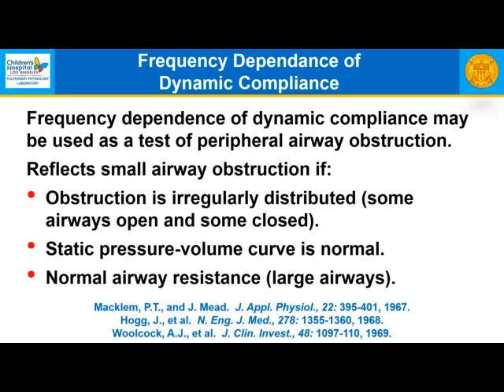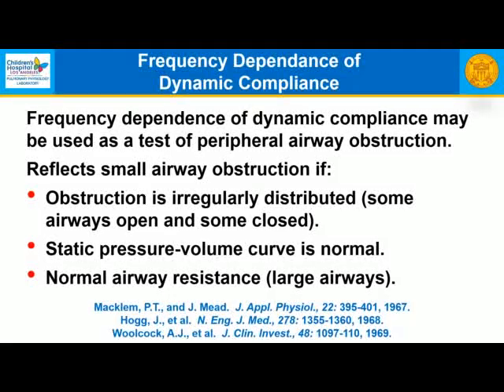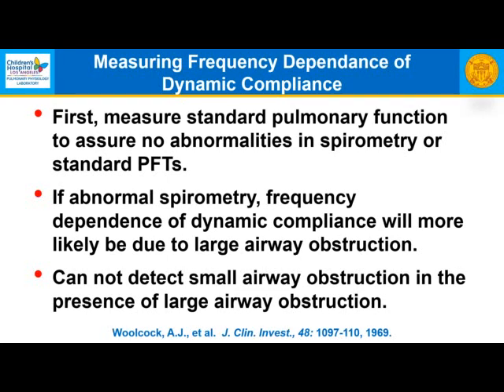It reflects small airway obstruction if obstruction is irregularly distributed, some airways open and some closed, and if the static pressure volume curve is normal. Also, you want normal airway resistance in the large airways. So to measure this, you first need to measure standard pulmonary function to assure there are no abnormalities in spirometry or standard pulmonary function tests.